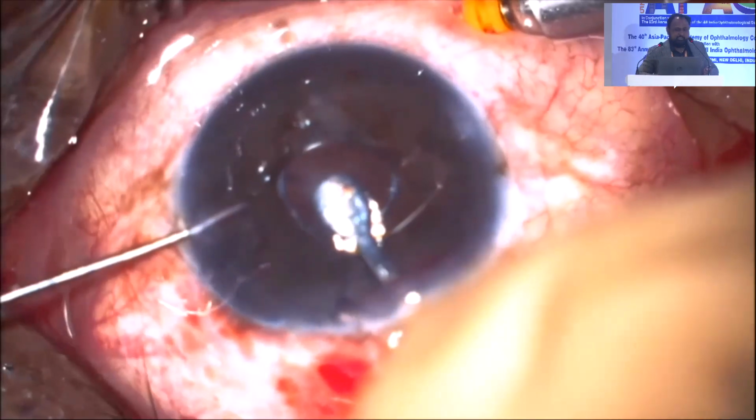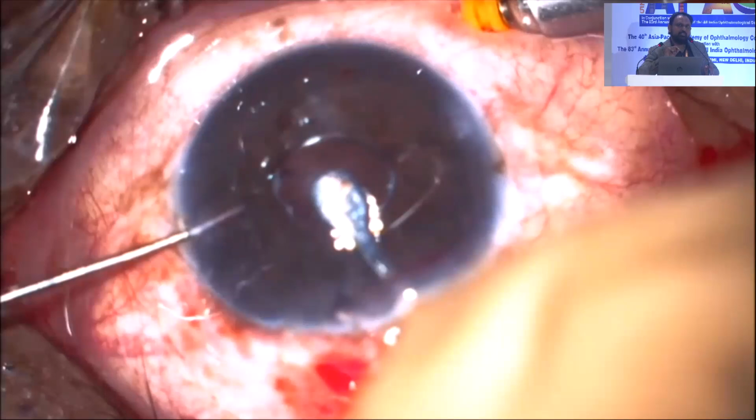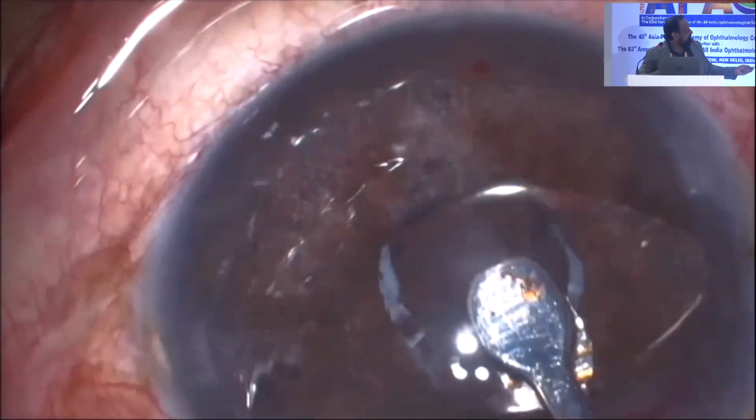The second thing is your right hand has to move up and your left hand goes down. This happens simultaneously, and when this happens, you see the tug and you can see a small dimple. So it's going on to the other side. Again, the firm grip in the center is very important. My second instrument is already there in the mid periphery.